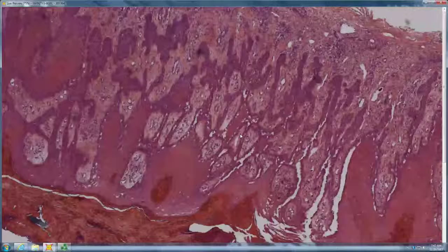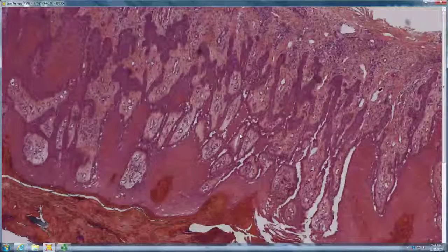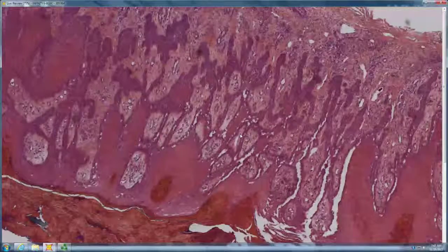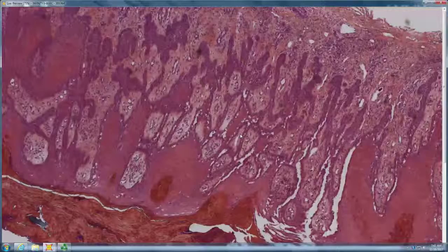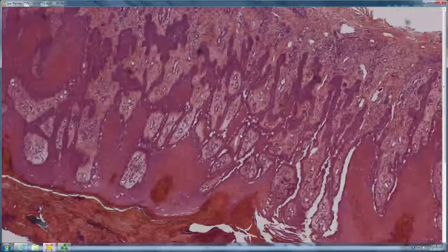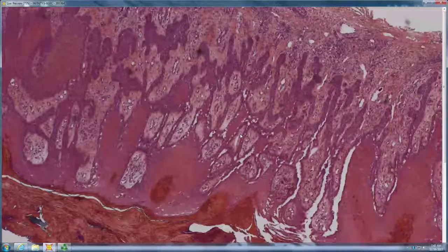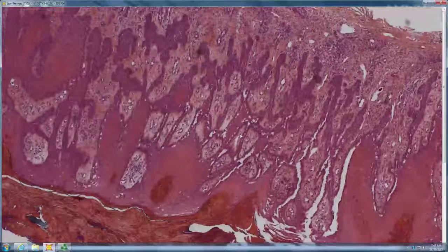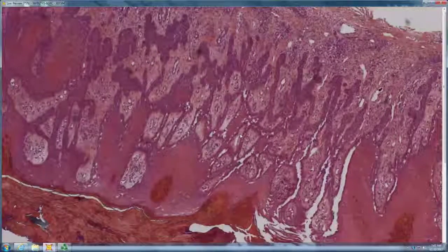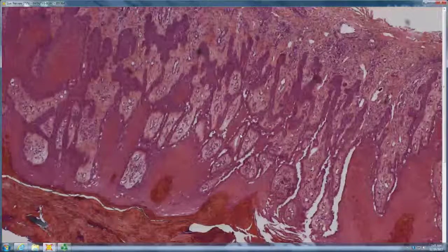Other things that are localized include acantholytic dyskeratomas, which are stuck on and look kind of like seb Ks, and vulvocrural acantholytic dyskeratosis, which is scrotum and usually vulva in women. They are keratotic lesions of the vulva in women, thought to be venereal wart or cancer, not sure what it is. They get biopsied, and it looks like Darier's, but they don't have Darier's elsewhere.